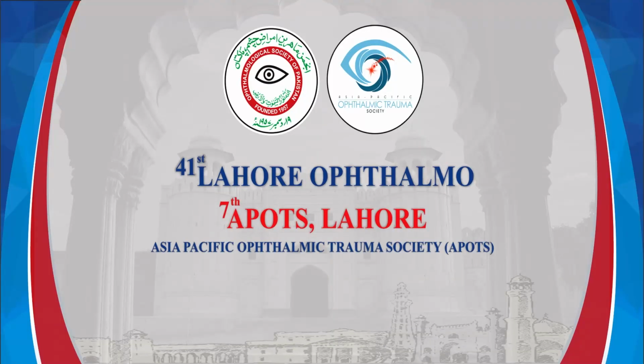Yes, thank you very much for the question. Of course, regarding the PFCL drops in the macula, you are right, you have to be careful. You have to keep one bubble of PFCL, and this resolves all the problems. But regarding the amniotic membrane, I do not have as much experience removing it.